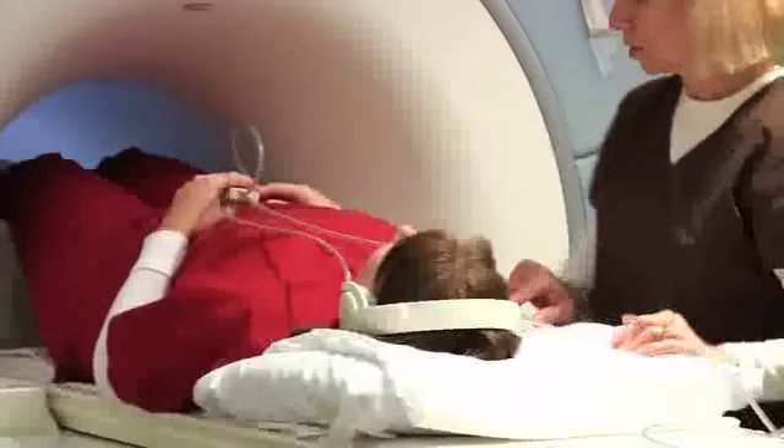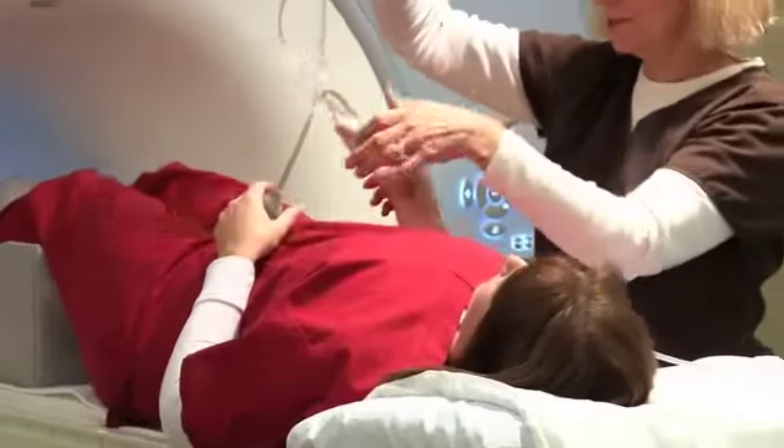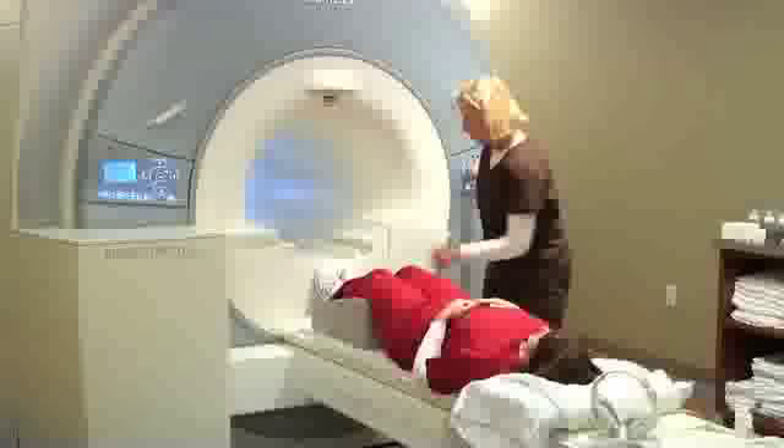Once the scan is complete, the technologist will re-enter the room, slide you out, lower the table, and help you off.